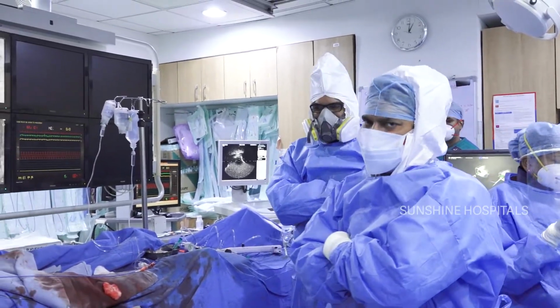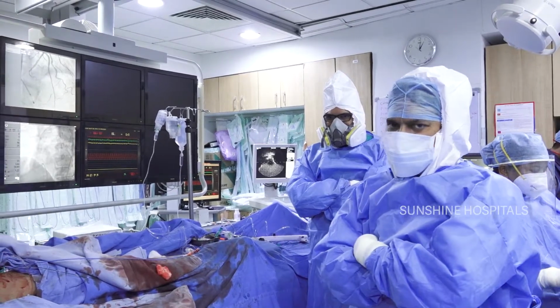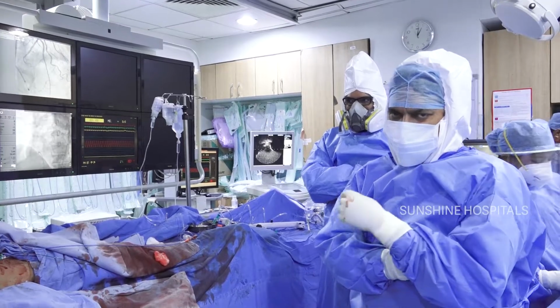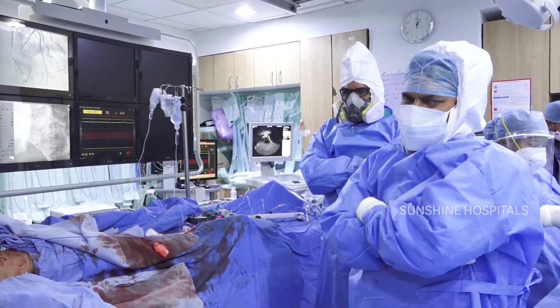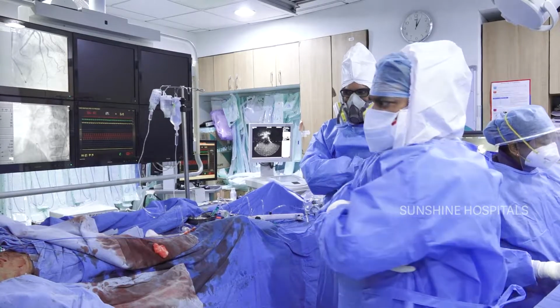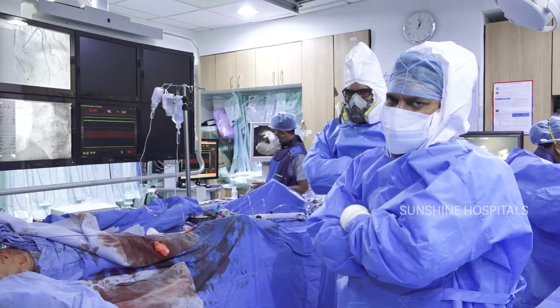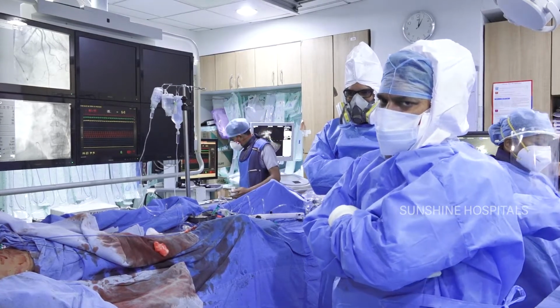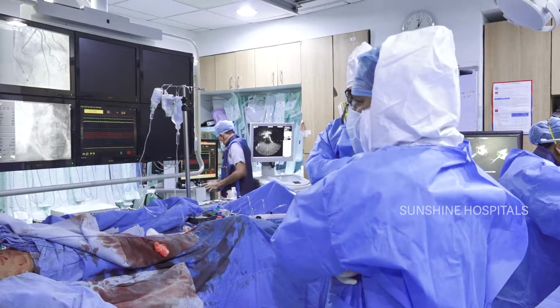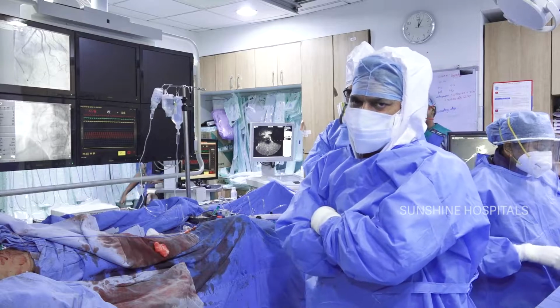Initially we thought we'll do it from the right radial, 80-year-old male, but because of the calcified, slightly abnormal location of the ostium of the left main, we were unable to engage with various catheters. We tried Amplatz 1 and 2, we tried JL catheter, EBU, XB. So there was no proper alignment. That's the reason we changed it to the femoral approach.